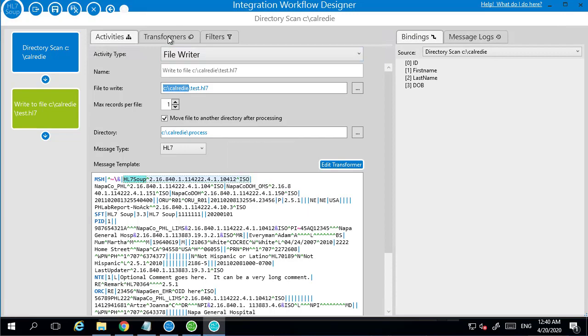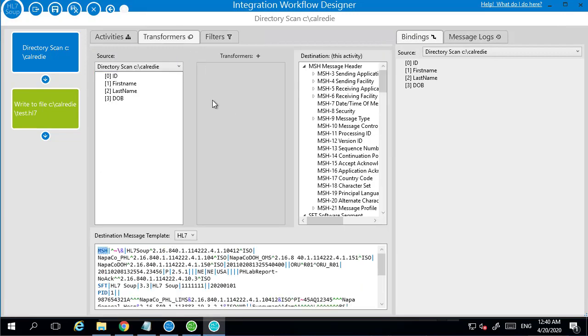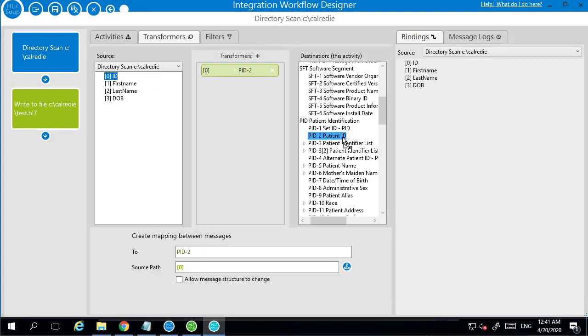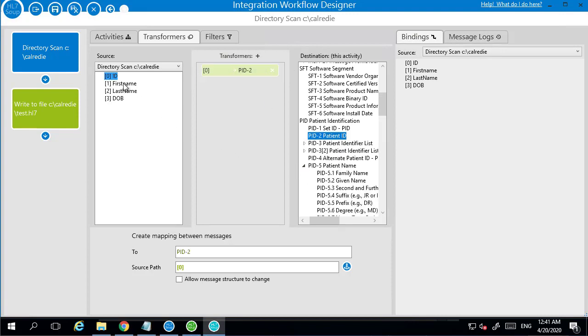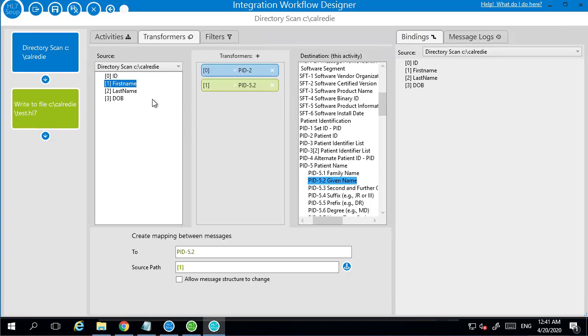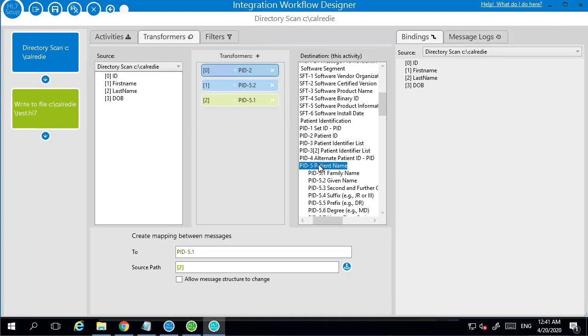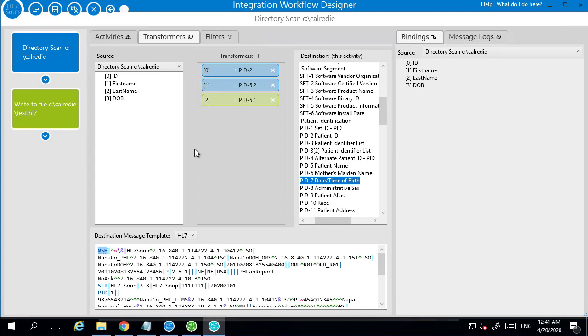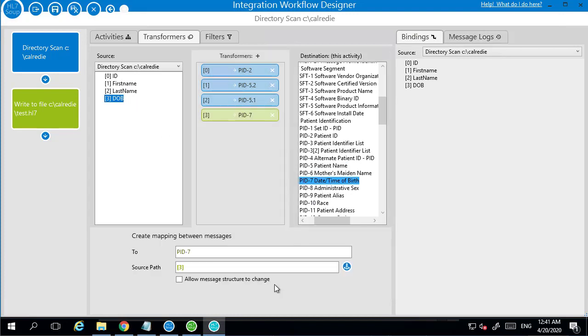Now we've just got to map those values that you've got coming in into this message. So to do that I'm just going to go into my transformers. You can see it's worked out from those headers that I gave it, all the fields that come in. This is a tree representing the outbound message, and so now I can just map the bits together. So I've got to map the patient ID, the PID patient ID with the ID coming in. So I can just drag that across from there to here, and it's created a binding between the two. I can do the same with the patient's name. So I bring the first name in, map it to the given name, the last name to the family name, and I'll also do the date of birth and map that across as well.